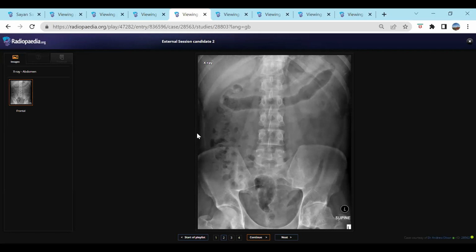It could be an ischemic pathology, but considering that the patient has a history of inflammatory arthritis, I'm thinking along those lines. Suppose the patient did not have any history of inflammatory arthritis, in that case, it could be an ischemic etiology, an infectious etiology, or an inflammatory etiology causing colitis involving the transverse and the descending colon.